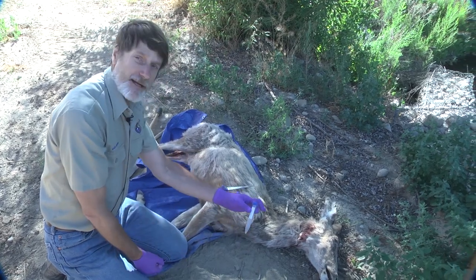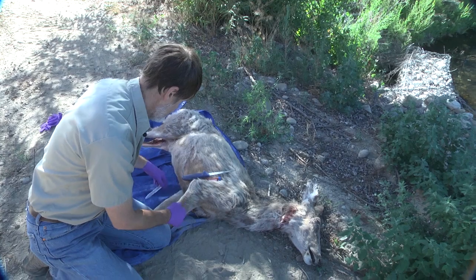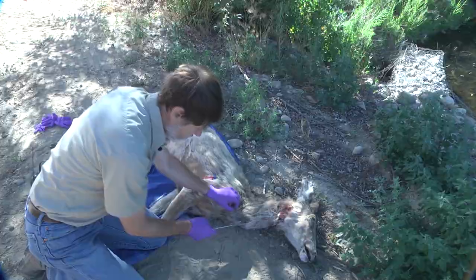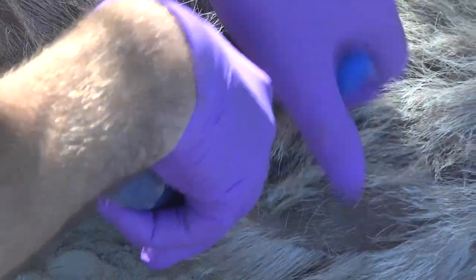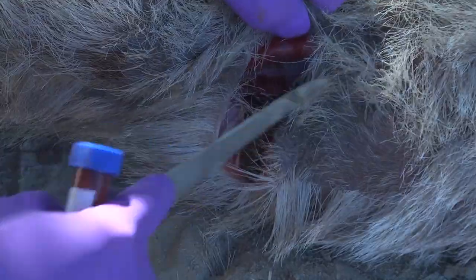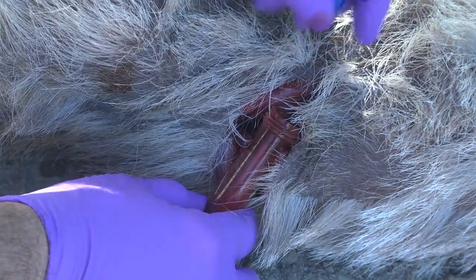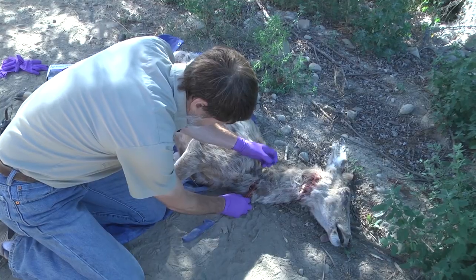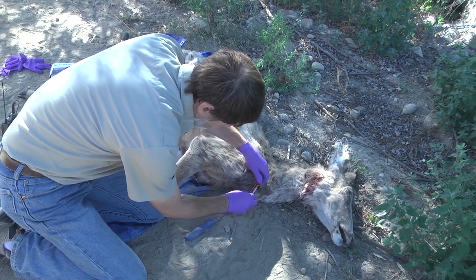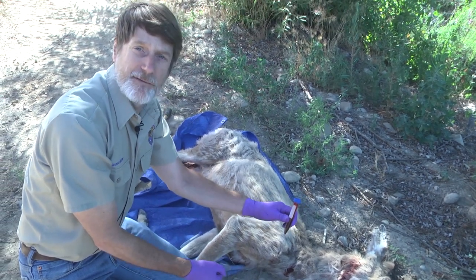I've got my animal, we've got a tube. We're going to make a cut across the jugular vein and the carotid artery and fill our tube with blood. We're going to put the cap on, and now we're going to get this ready to get mailed.